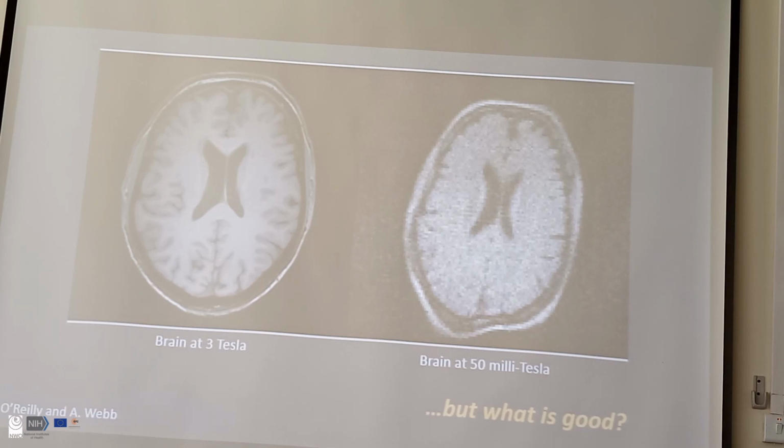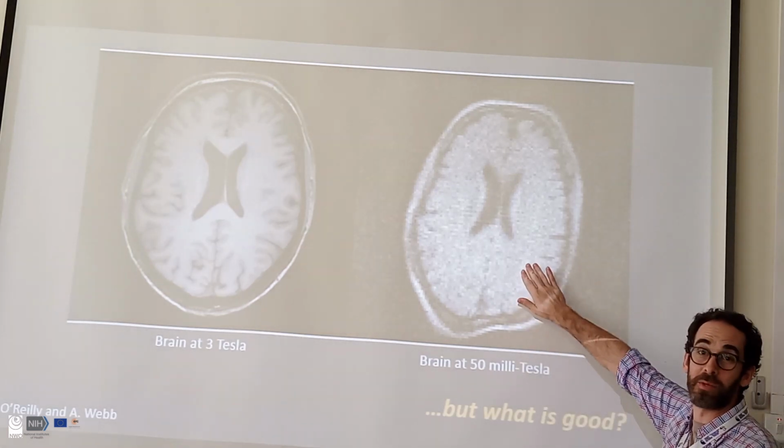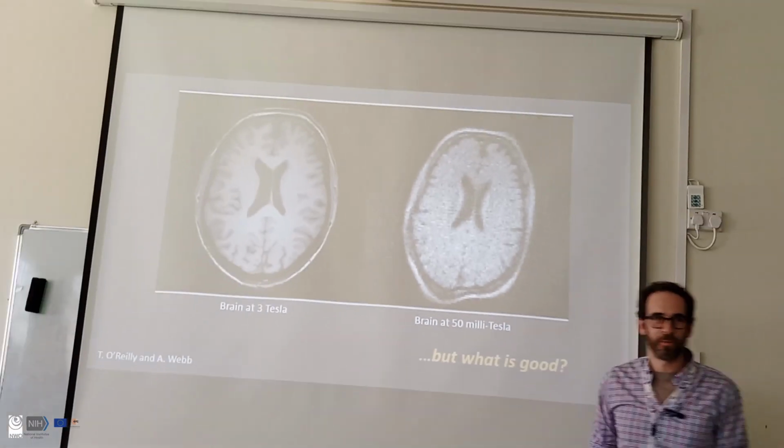Here's a side-by-side image of the same brain on a 3 Tesla system at Leiden and a 50 millitesla system that's currently sitting downstairs, also at Leiden. And I would also comment that Tom would want me to put a much nicer image on this now, because the system's come quite a ways.